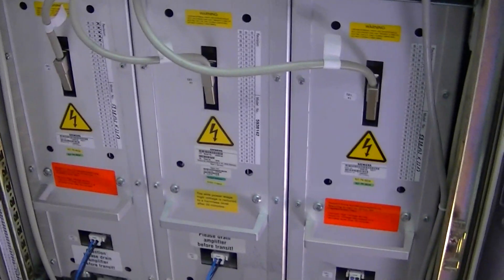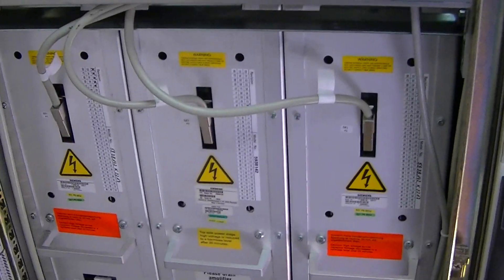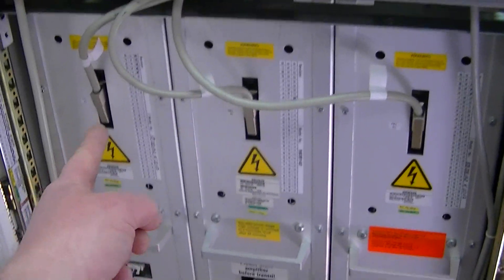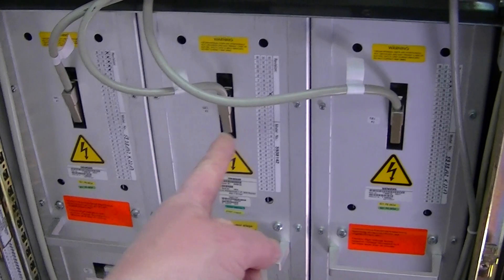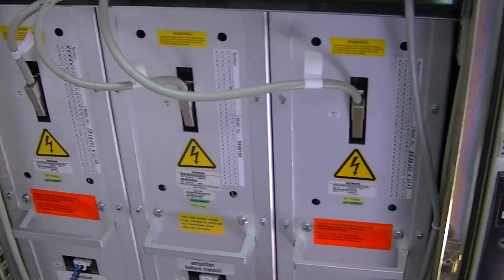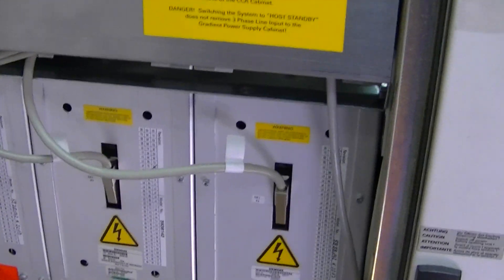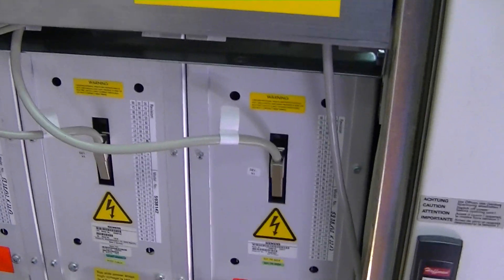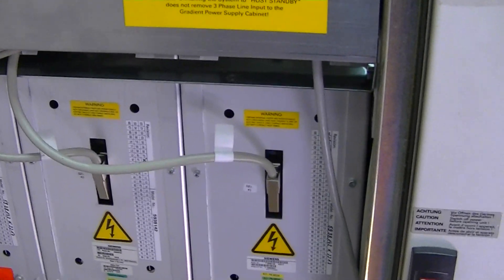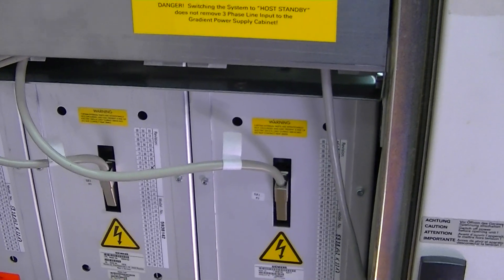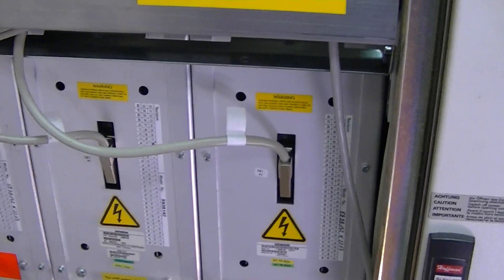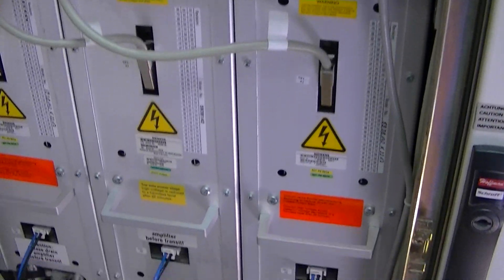These are your gradient amplifiers. They're literally x, y, and z for each axis. These happen to be quantum gradients, so they're the highest gradient strength that you can get for a Siemens symphony.